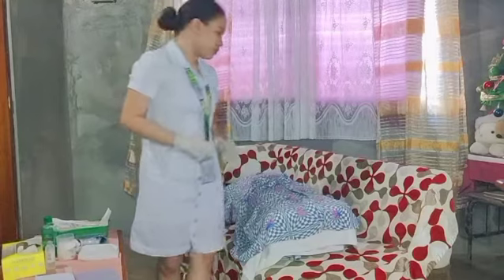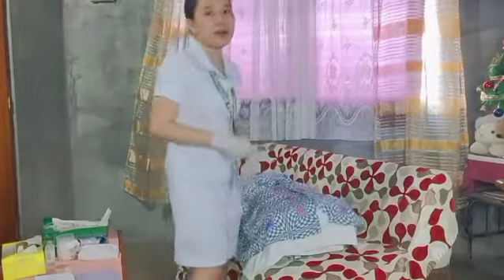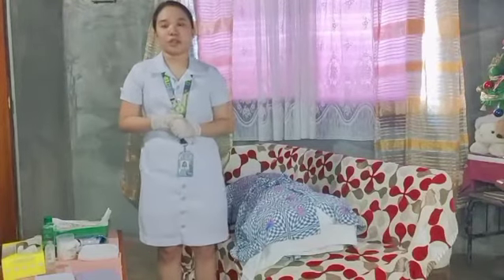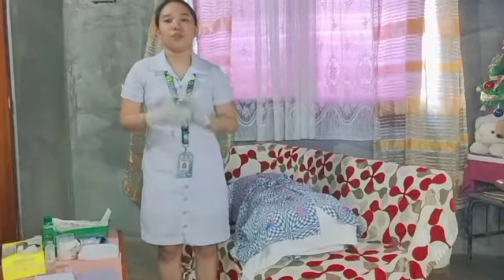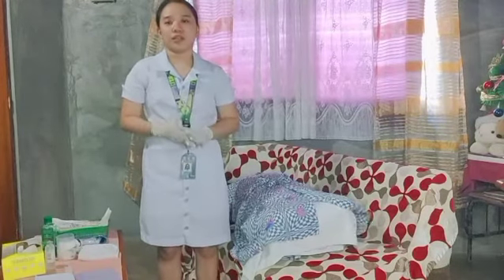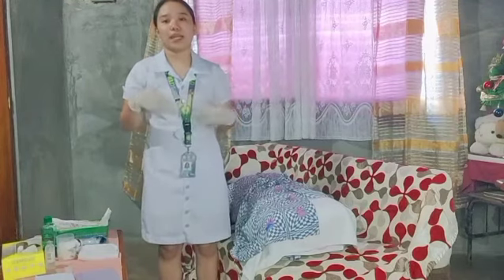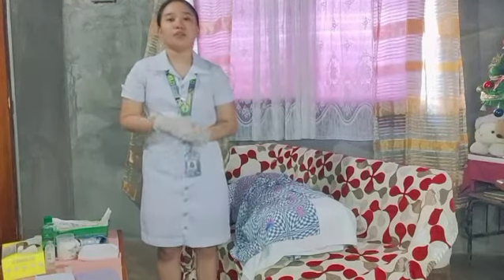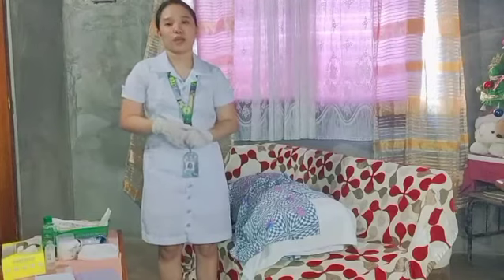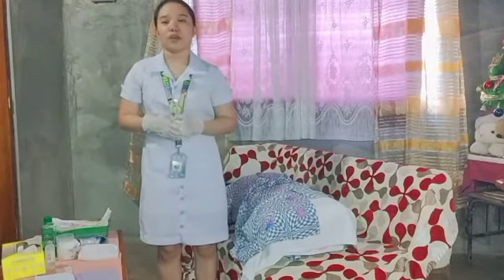So, ma'am, let's lie down properly. Okay, thank you, ma'am. After positioning the patient into dorsal recumbent, observe proper draping, inspect the perineal region for erythema, drainage, and odor, and also assess perineal anatomy, and you should apply clean gloves upon examining. But first, we need to place a waterproof pad under the patient so that it will prevent soiling of bed linens.